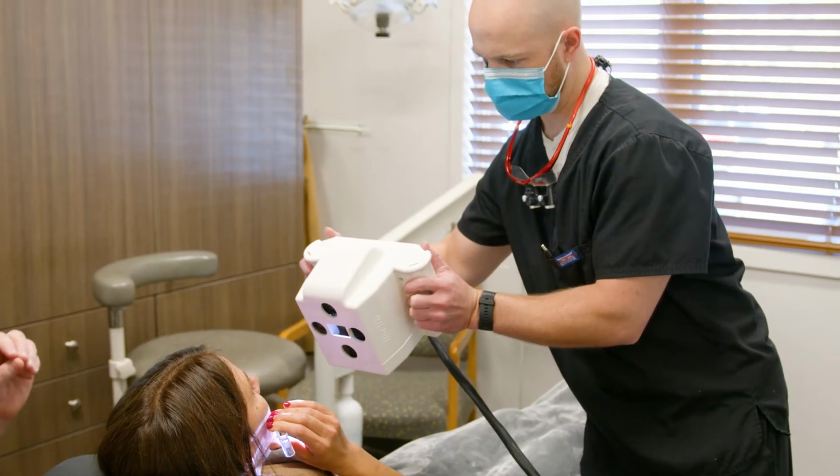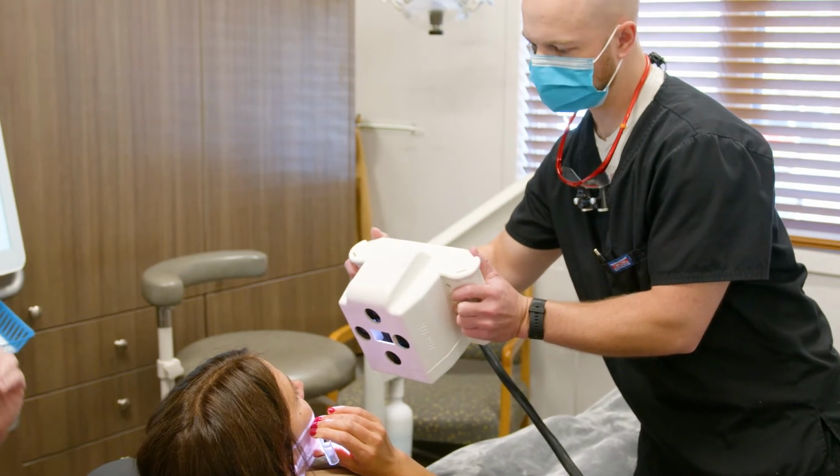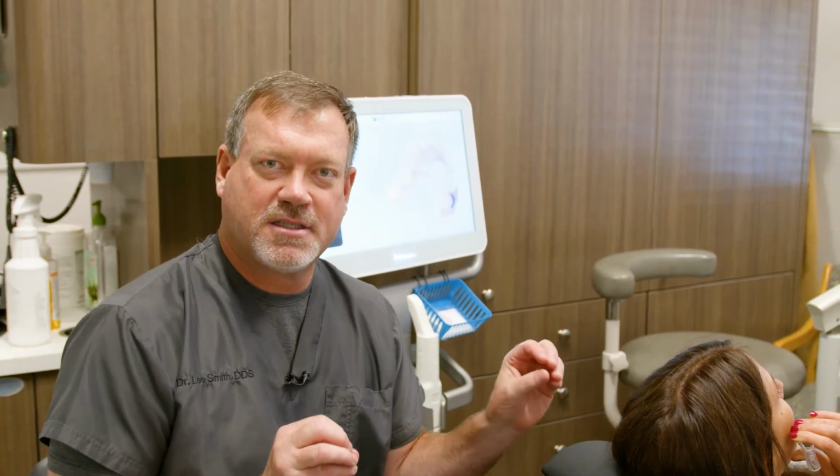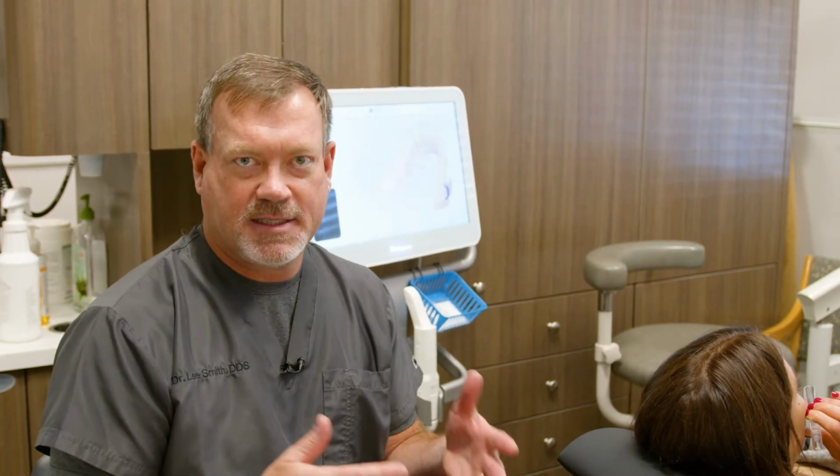So what Dane is doing here is actually recording the implant position, not only in the XYZ axis, but also to each other. And it takes that long. He's just about done with it, and that's it. And that is the process that replaced all those other appointments, which took, like I said, 10 to 15 hours of clinical time in my hands.